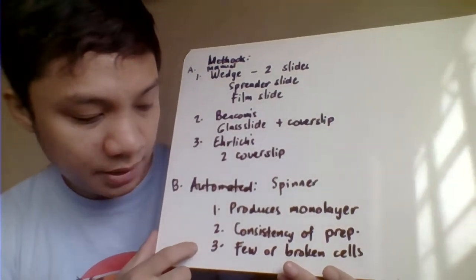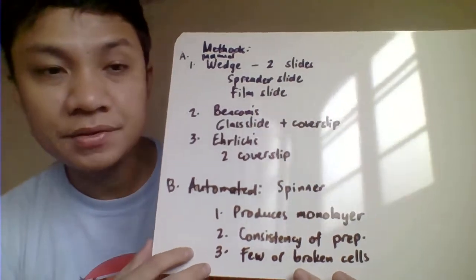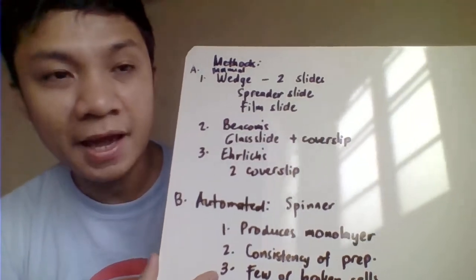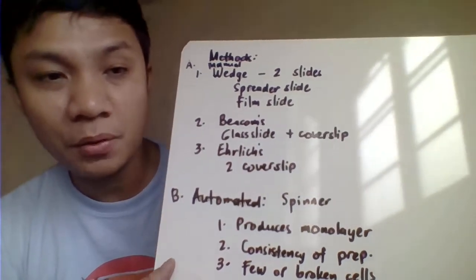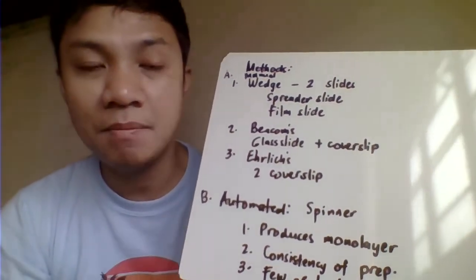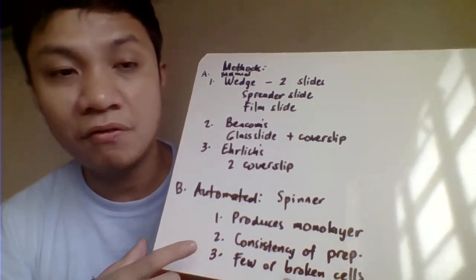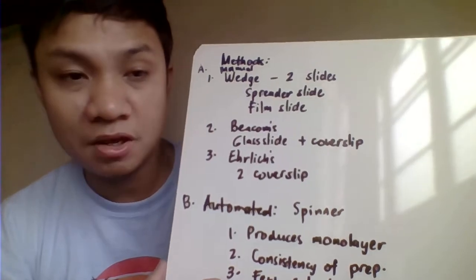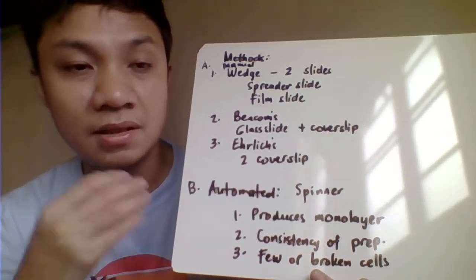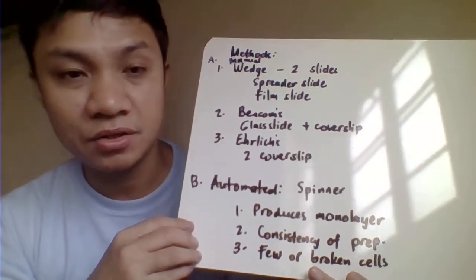And another one is that distorted or broken cells could be produced. Again, with distorted or broken cells, if you try to examine those under the microscope, you might mistake them for abnormal cells, and of course, it will alter your interpretation and reporting. And that's prevented if you have this automated blood smear preparation.